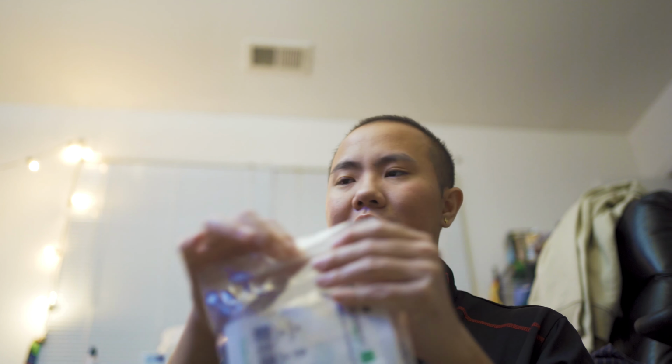So the first thing we're going to start with is an emergency change kit, and that's what I think about every time I leave, just to make sure that my bases are covered. We don't want to go out and need something, but find out that we have to run all the way back to get it, right? So, emergency change kit. I use these little bags that come in with my medical supplies. If you get medical supplies delivered to you, you'll probably have some sort of bag, or you can use a little pouch or whatever.